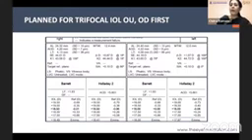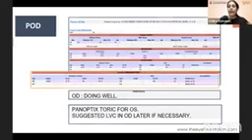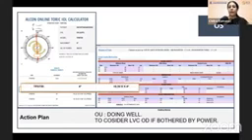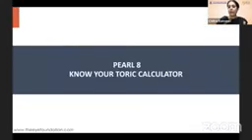He did have 0.8 diopter of astigmatism, which was overlooked, and a PanOptix was implanted. This patient had a small amount of astigmatism and was not happy. I convinced him that we would do a laser touch-up after a period of time, and went ahead and did a PanOptix toric in the other eye. Looking into all the factors, implanting the right toric IOL, we found that this patient, with the laser vision touch-up in the first eye and the PanOptix toric in the second eye, did well.